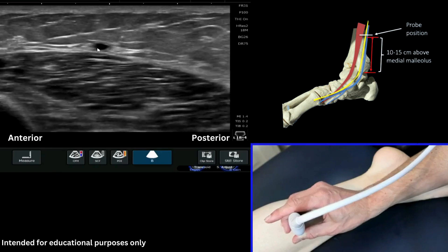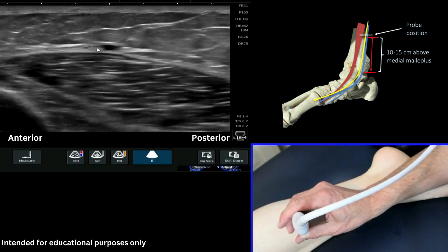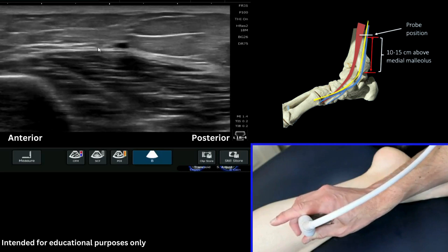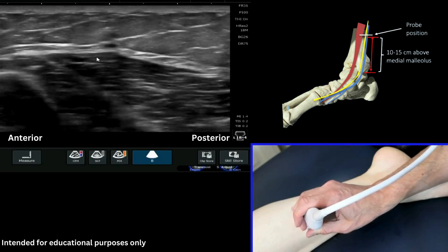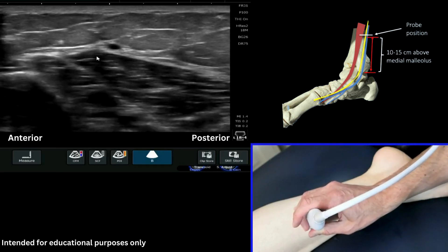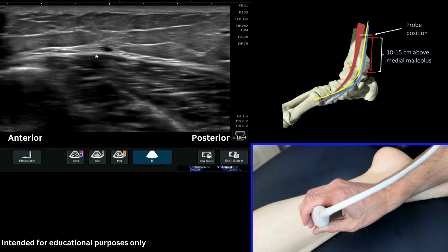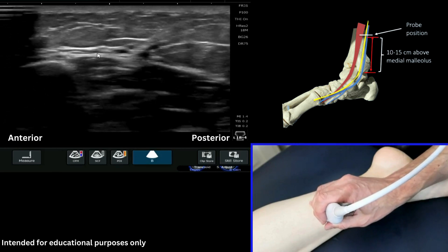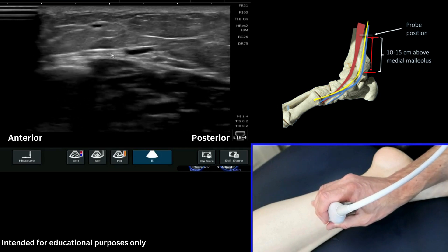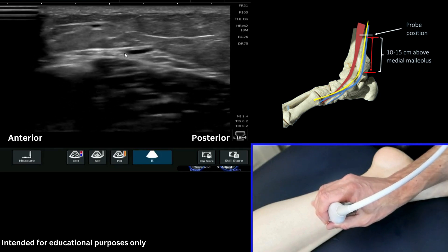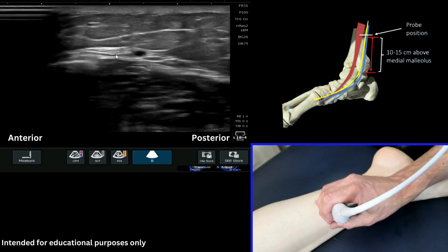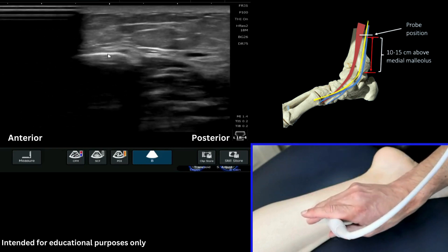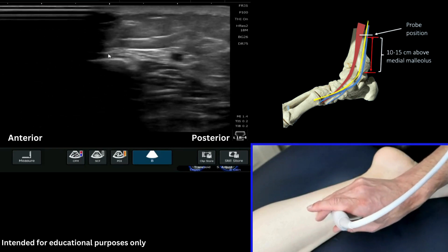Now if we run all the way down very slowly and carefully, you can see me changing the angulation of my probe — I'm trying to keep those structures centred for you. You'll see a few branches come off, but you'll also see it starts to migrate. Here's the nerve, here's the vein. As we start to migrate down it does start to come that little bit more anterior.